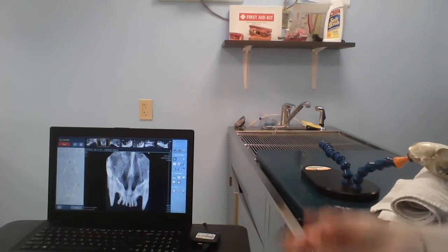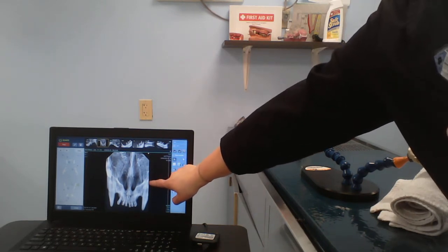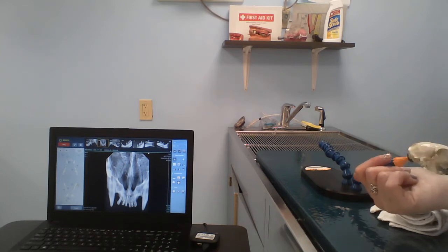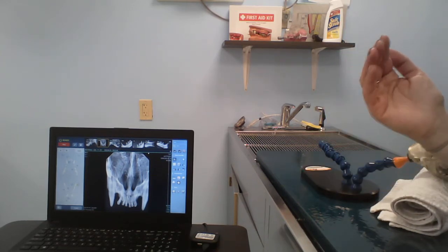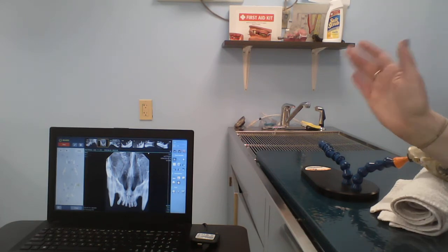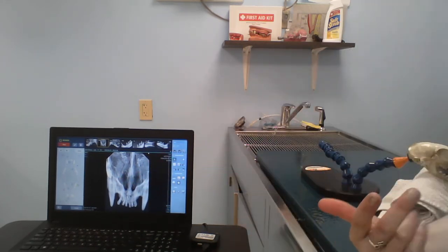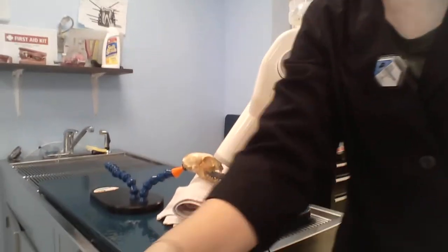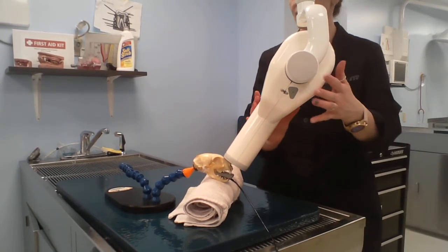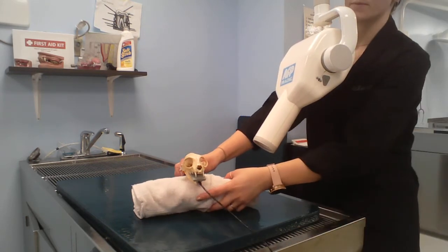So we can see here we have both upper canines and all the incisors in one shot. You can see that I have cut off the one canine just a tiny bit. I'm not too worried about that because I will pick that up in my next lateral view. That happens quite a bit, depending on how wide your cat's head is, or how far apart the canines are. So don't worry about that. Try to get it as straight as you can. This is also a really great view for your sinuses. Cats are very, very prone to having sinus tumors. So this is a really good view, and I mentioned that when we did canines.